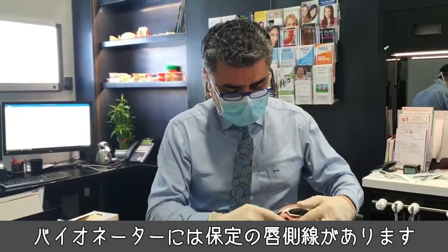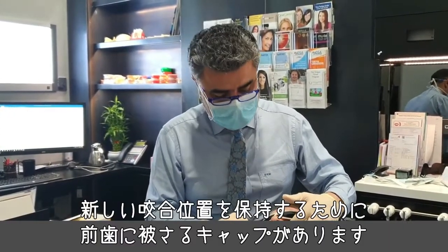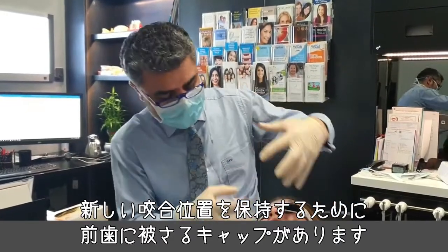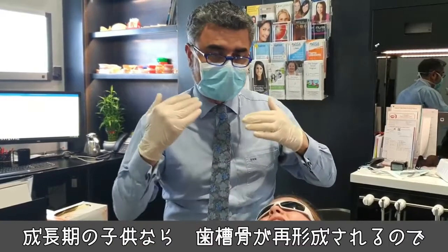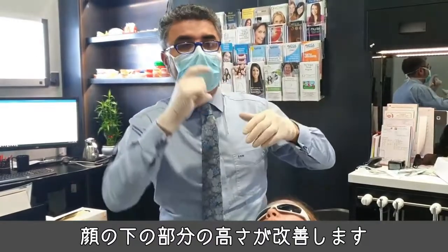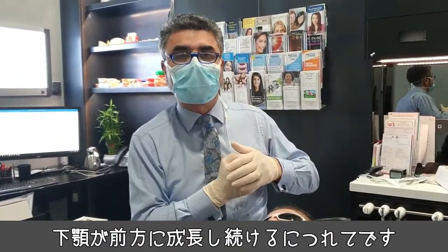The bionator to open has the labial bow for retention and incisal capping to hold the bite in the new position. We allow the molars to erupt, and in a growing child, what happens is the dento-alveolar bone remodels. So you're actually getting improvement in the lower face height as the lower jaw continues to come forward.